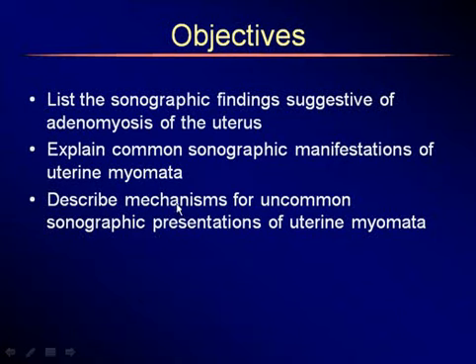The objectives of this talk are for you to be able to list the sonographic findings suggestive of adenomyosis, to explain the common sonographic manifestations of uterine myomata, and to describe mechanisms for uncommon sonographic presentations of uterine myomata.